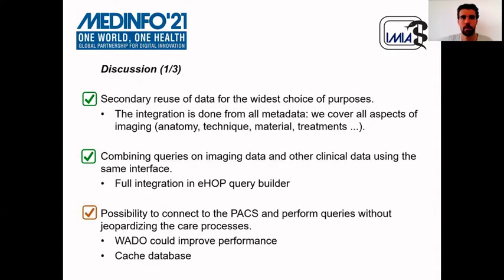To discuss this work, we will return to functional and technical requirements. The integration is done from all metadata. Technically, we use C-MOVE queries on the PACS, so we get DICOM files, and we have all available DICOM metadata. We cover all aspects of imaging: anatomy, technique, material, treatments. We can combine queries because we made a full integration of imaging data into the EHOP data model.